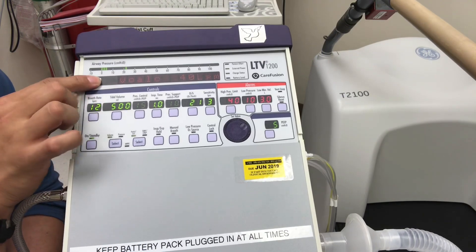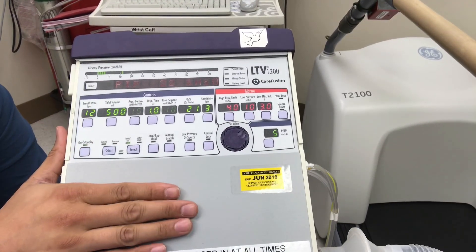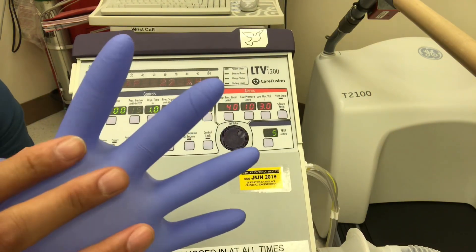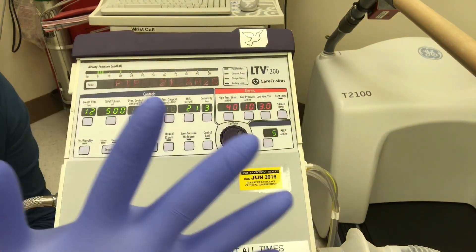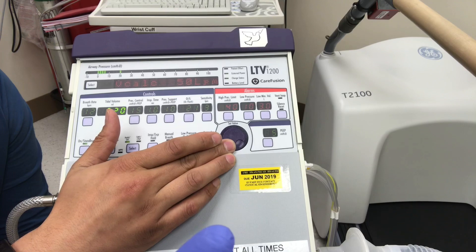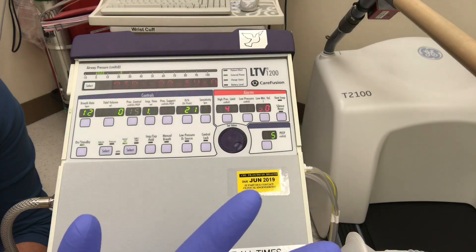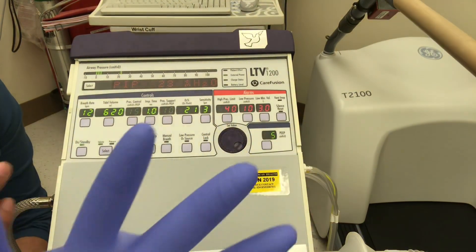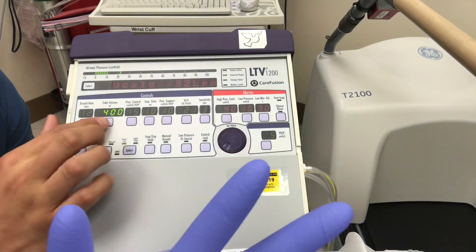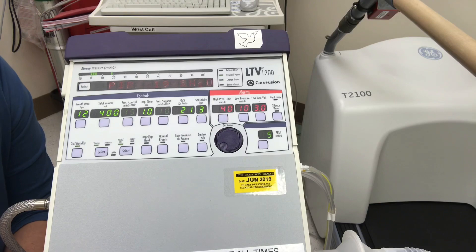Let's look at peak inspiratory pressure in relation to tidal volume. As I said before, the lung is like a balloon — the more volume you put in, the tighter it becomes, which becomes detrimental with sick patients. We have a PIP of 21 cmH2O at 500 mls. If we go up to 620 mls, the PIP climbs to 23. Now let's go to lung-protective ventilation at 400 mls — and the peak inspiratory pressure drops to 19 cmH2O.